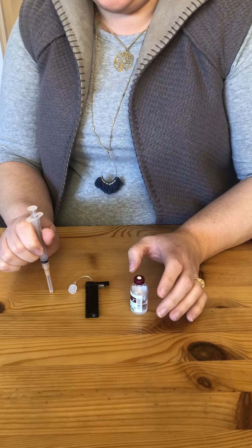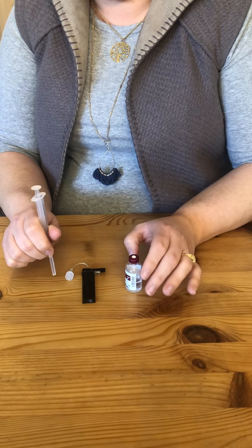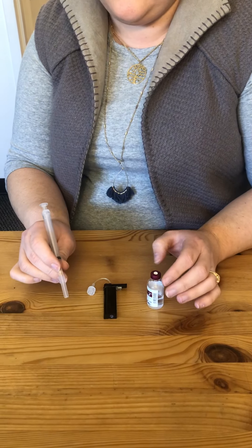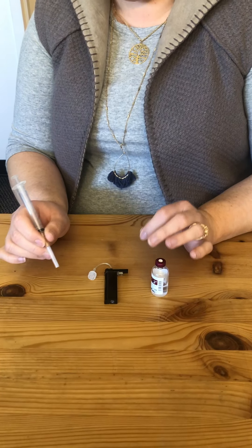One of the most common issues with the tandem pump is the cartridge refill procedure. It's definitely the place where there's the most room for error and we get a lot of questions — a lot of people are doing it wrong and having problems. So I wanted to show you the easy way to do it, the fast way to do it. The way I do mine doesn't exactly match the tandem video.